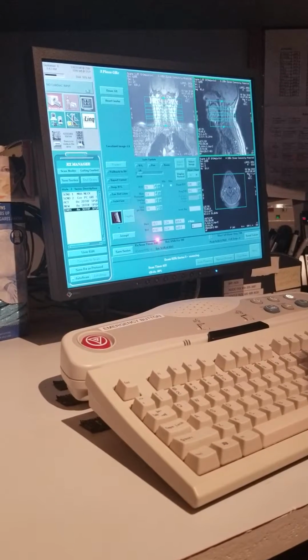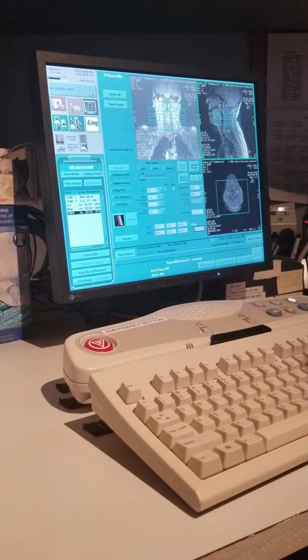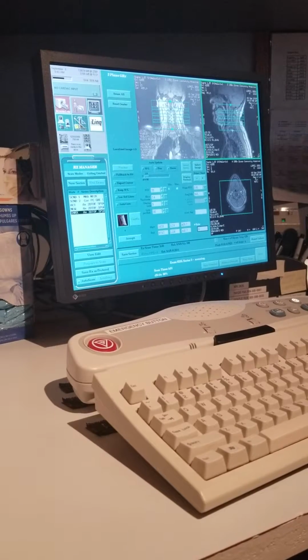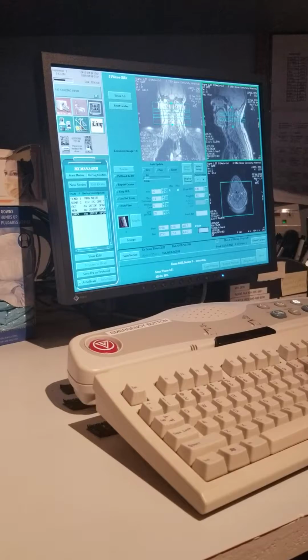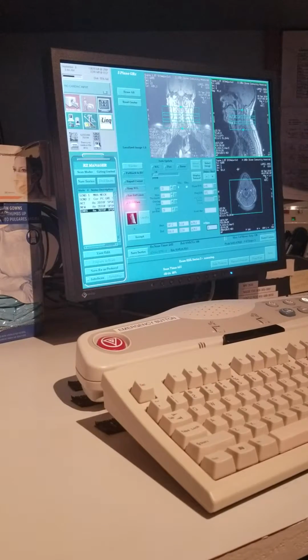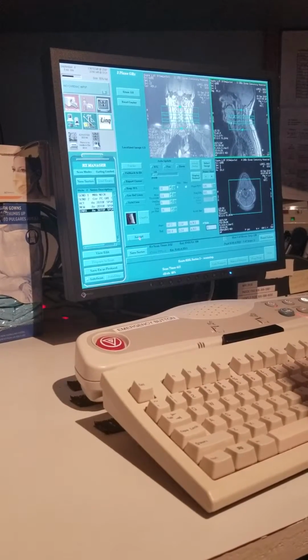And the time is directly related to that, because now you have fewer slices because you have 4 slabs. And let's make it 3 slabs. Okay. So we'll bring that down a little bit. Somewhere around here is going to be the bifurcation, but we're not going to know until we actually see it. Auto view. Accept it?